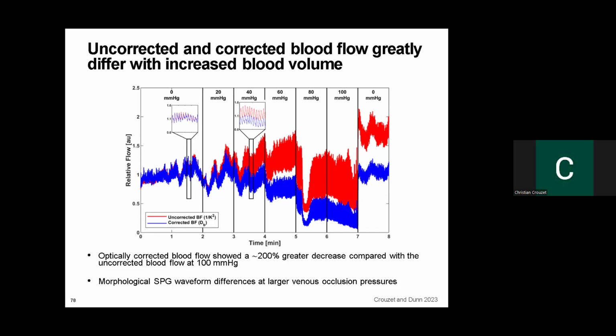Yes. Yeah. So I believe Bernard will be going more into that in the next lecture, a little bit about the impacts of how speckle contrast is impacted by absorption and scattering. But there are basically models where you input optical properties to get your corrected flow value. So I'll let him go over that a little bit more. And in the lab, also, there's a little bit of that.